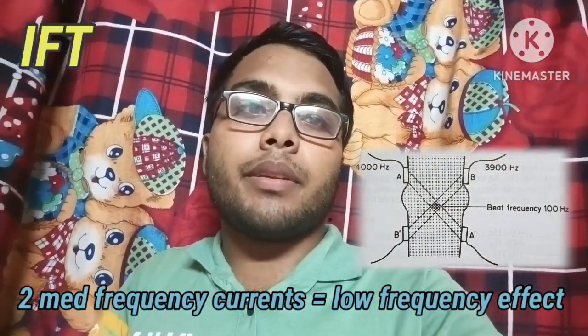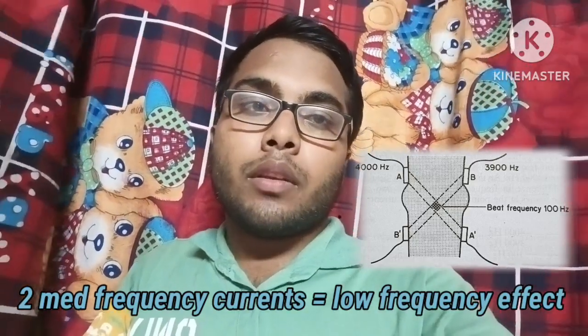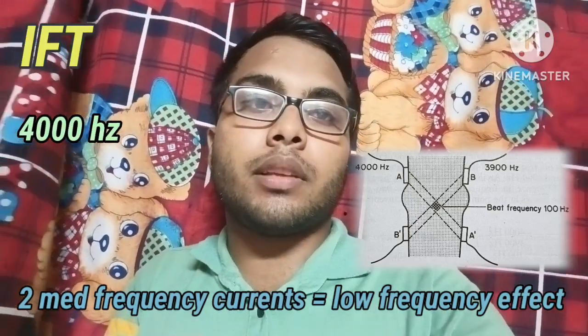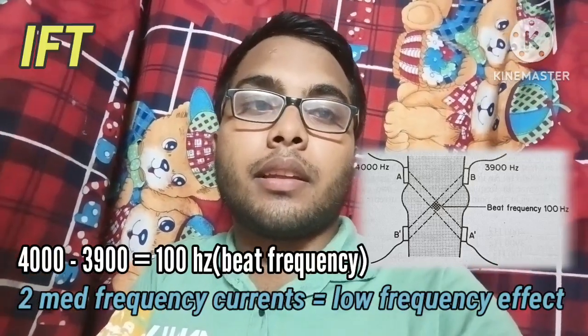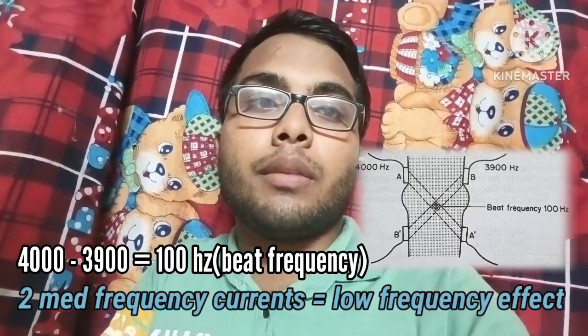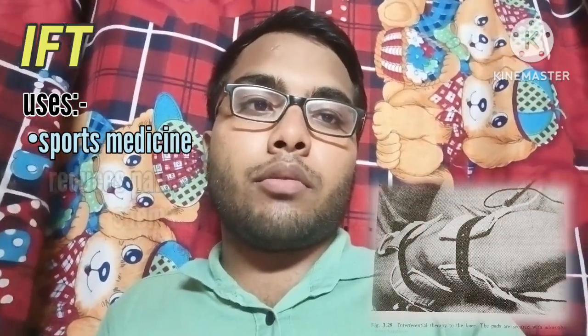Coming to the parameters, we use two medium frequency currents in IFT. One has a constant frequency of 4000 Hz and the other between 3900 and 4000 Hz. The difference between these two medium frequency currents creates the interference effect in the patient's tissues, and that frequency is called the beat frequency. IFT is used in the sports medicine area to reduce pain and to reduce edema.